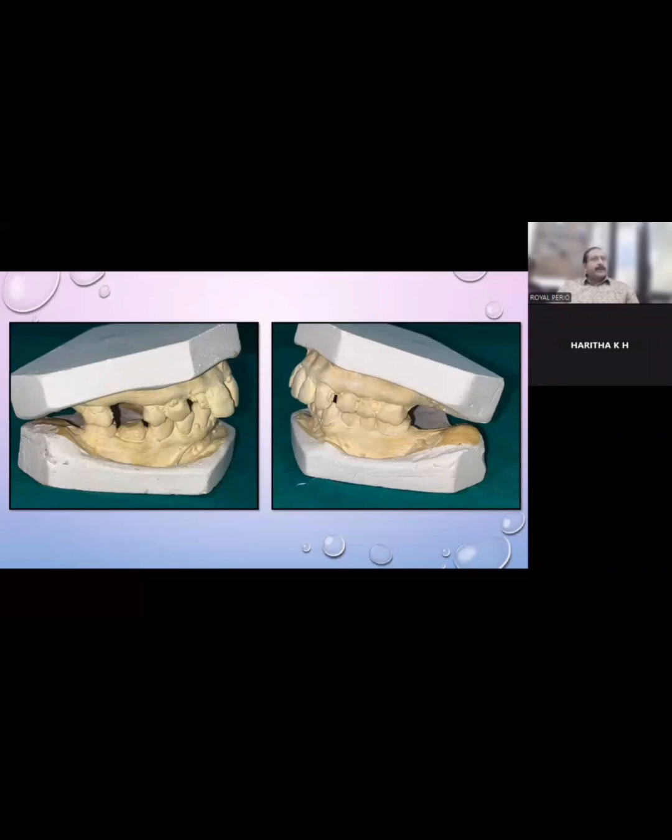Yeah. But here we need to know the density of the bone. If density is still less, then don't take a risk because you're going to go in for a sinus lift. So the primary stability will be only from the surroundings, not from the apex. Since you are attempting a sinus lift, there will not be any primary stability from the apical region. So the primary stability has to come from the surroundings. So it's better that you keep it one drill less.